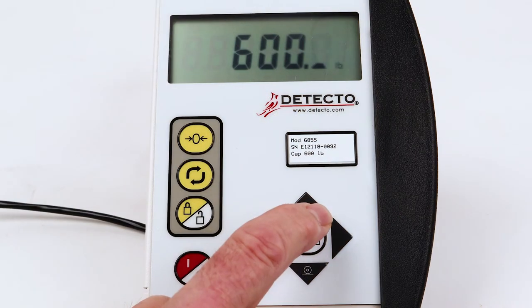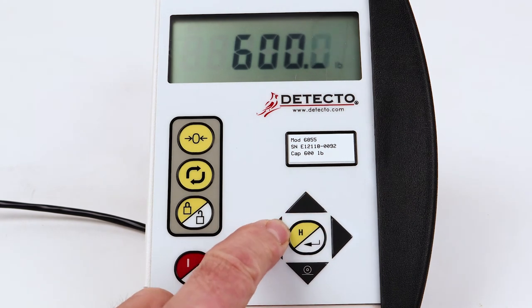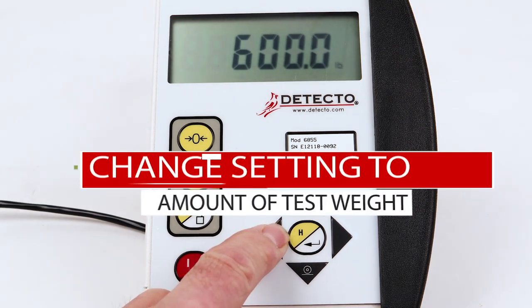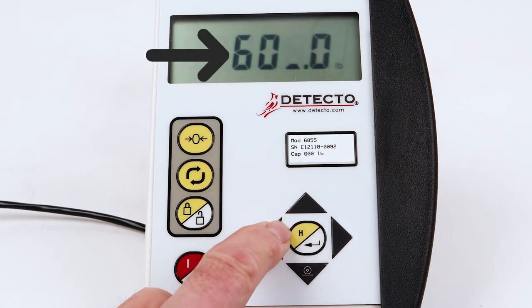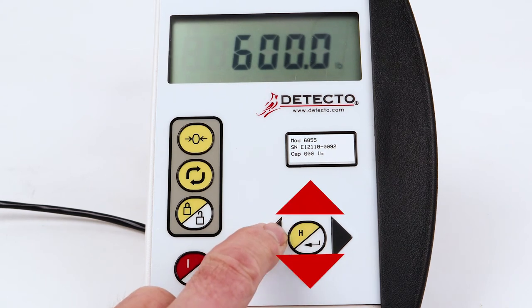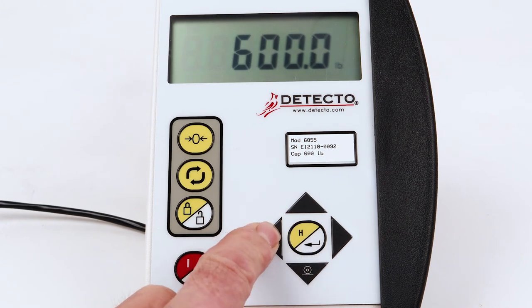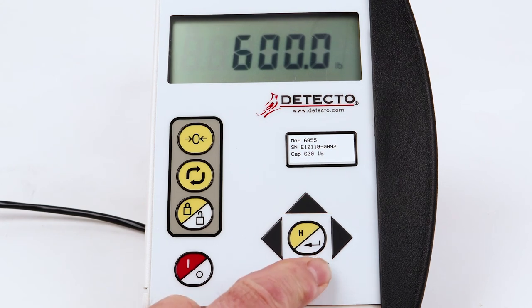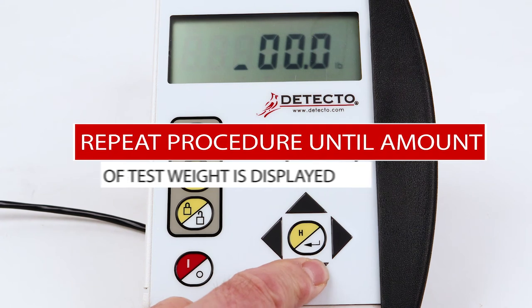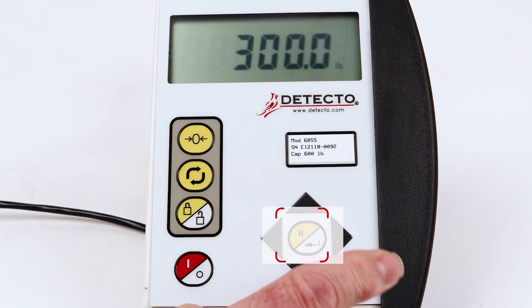The display will change to show the current setting. If the setting is the same as the amount of your test weight, press the BMI Enter key. Otherwise, using the arrow keys, change the setting to the amount of your test weight. Note that the blinking character is the position to be changed. Press the up or down arrow keys to scroll through the numbers. When the desired number is displayed, press the left arrow key to advance to the next position. Repeat this procedure until the amount of your test weight is displayed. Verify that the weight entered is the same as your test weight and press the BMI Enter key.